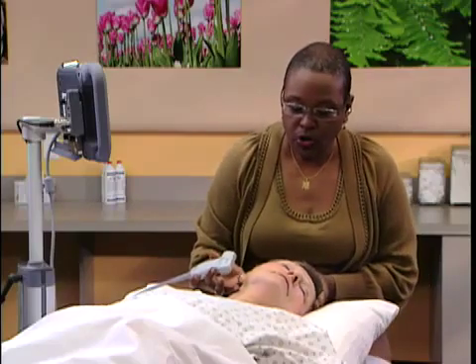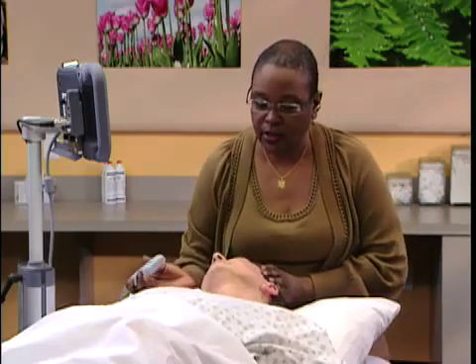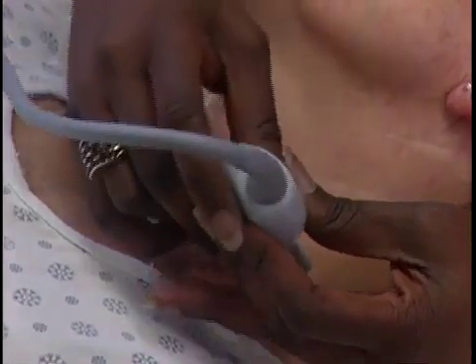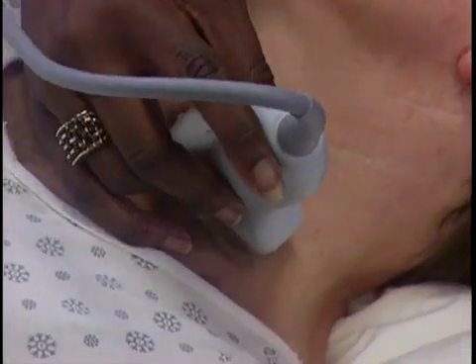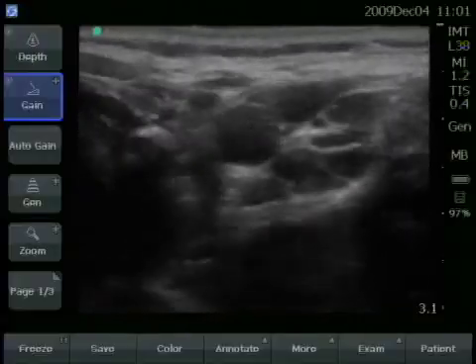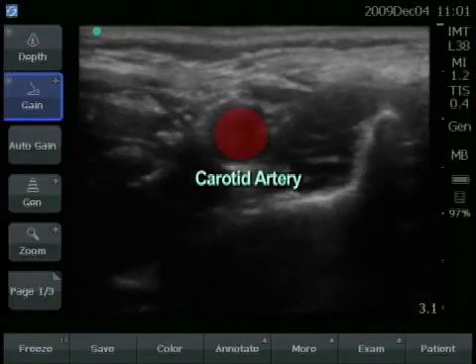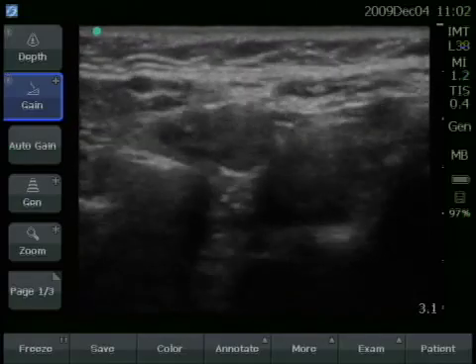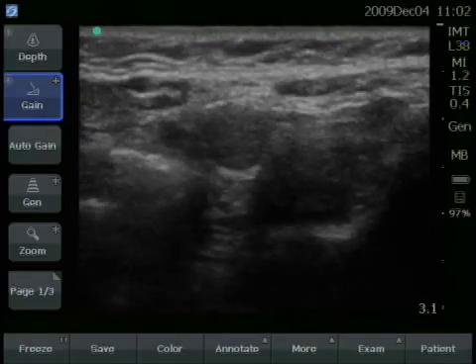Then you want to turn the patient's head so that it's facing in the other direction and perform the same exam from the opposite side of the neck. When scanning from the opposite side, the orientation marker stays the same way it was from the opposite direction. Scan up again in a transverse manner — the artery should be nice and round, and again you're looking for the widening of the artery wall to let you know that you're at the bulb.